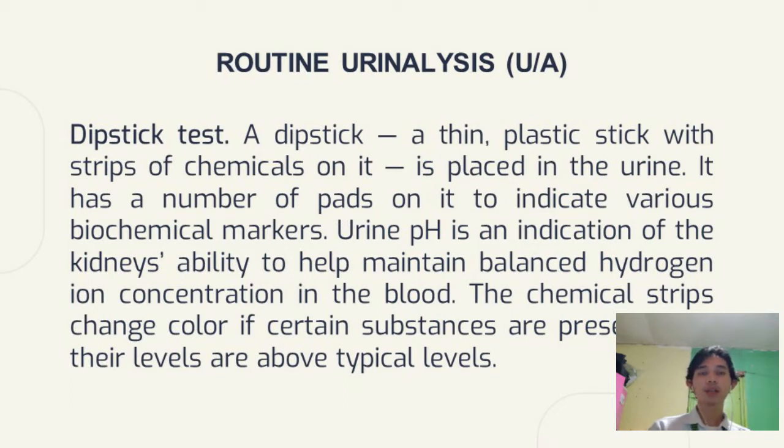Urine protein is the most common indicator of renal disease, although there are conditions that can cause benign proteinuria. Glucose is used as an indicator of diabetes. The presence of ketones indicates impaired carbohydrate metabolism. Hemoglobin indicates the presence of blood, which is associated with renal disease. Bilirubin is used in the detection of liver disorders. Urobilinogen indicates hepatic or hematopoietic conditions. Nitrites and leukocytes are used to test for bacteriuria and other sources of urinary tract infection or UTIs.